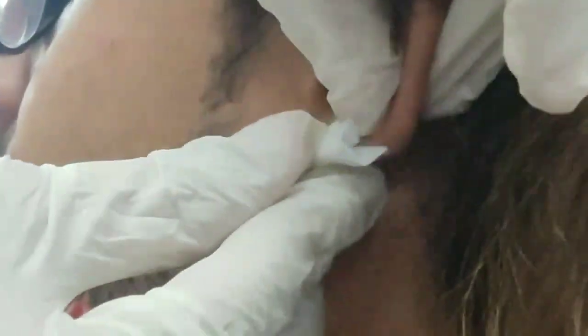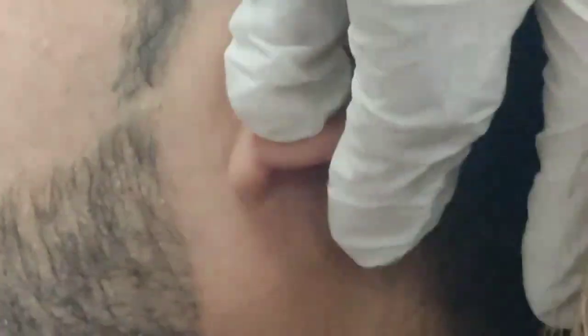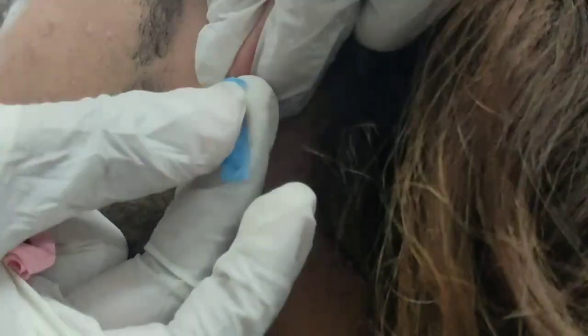To perform the test, first we clean the specific area of the body where we want to make the prick. We are using the earlobe, so first we clean the earlobe using the alcohol swab.